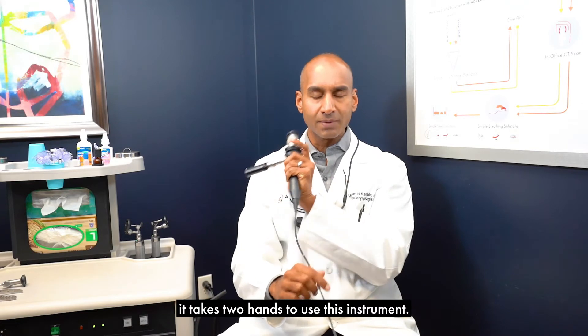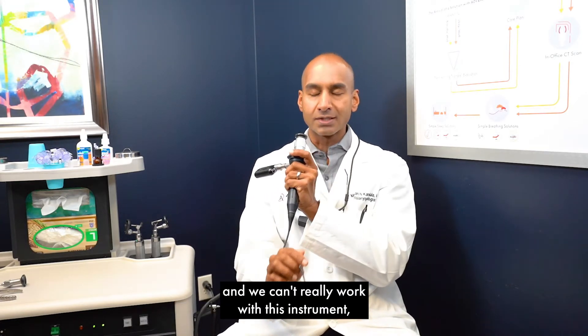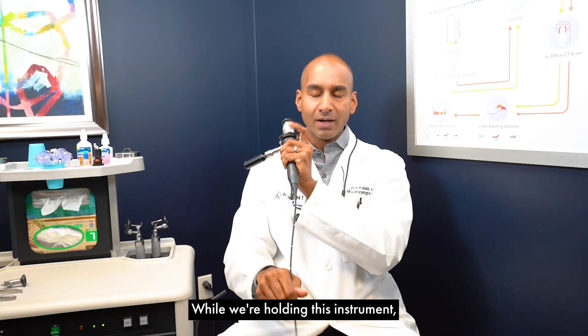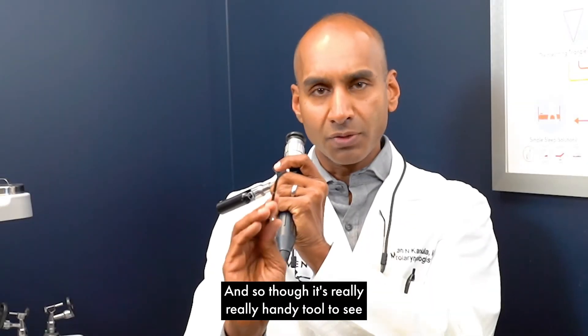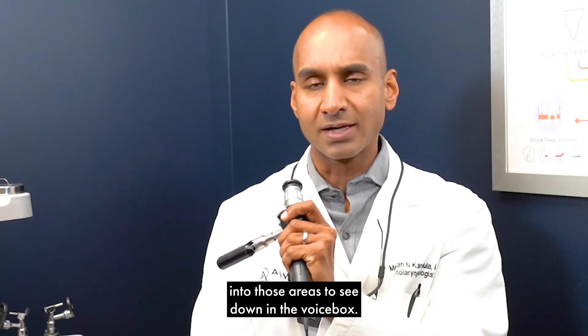It takes two hands to use this instrument. When we're looking through it, we can't really perform procedures at the same time because I need my left hand here and my right hand here. Still, it's a really handy tool to see into those areas — including down into the voice box if needed.